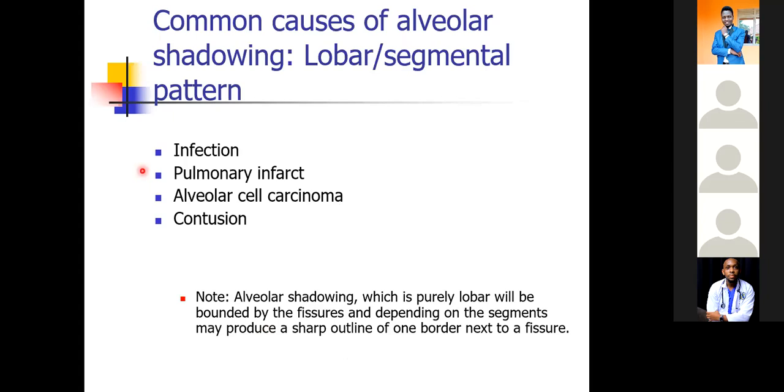But as we wind up that, these are some of the common causes of airspace shadowing: infections, pulmonary infarcts, tumors, and lung contusion in case of trauma.